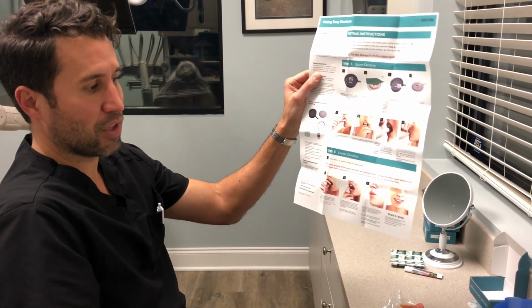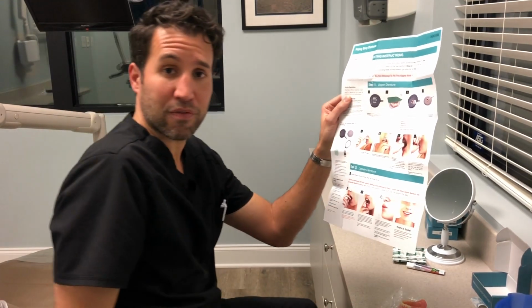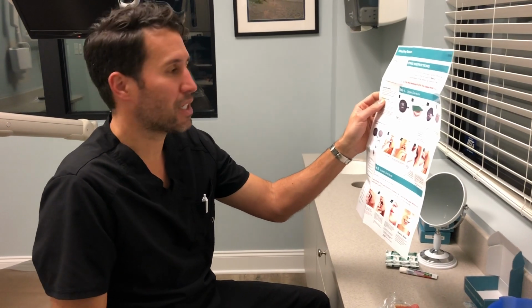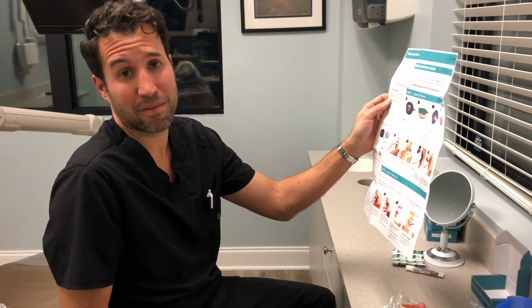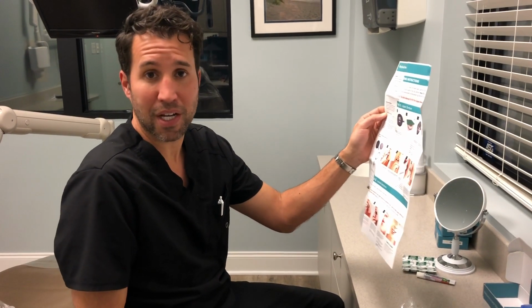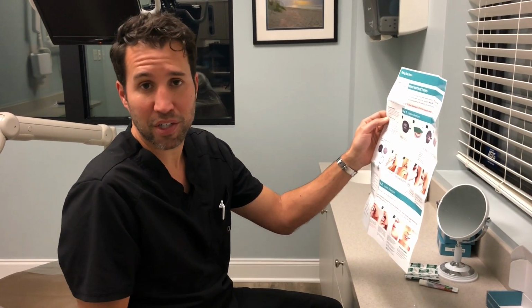Upper denture above, lower denture below. You start with the upper denture first if you're doing both arches at the same time. It takes about 5 minutes each. Sometimes a little less, sometimes a little more, depending if you have to refit it. But you can refit this thing up to 20 times. Put it in hot water. If it doesn't fit right, put it in hot water, do it again.